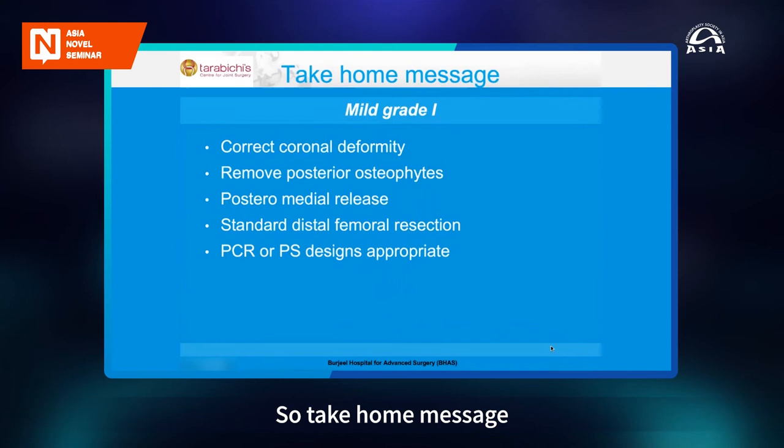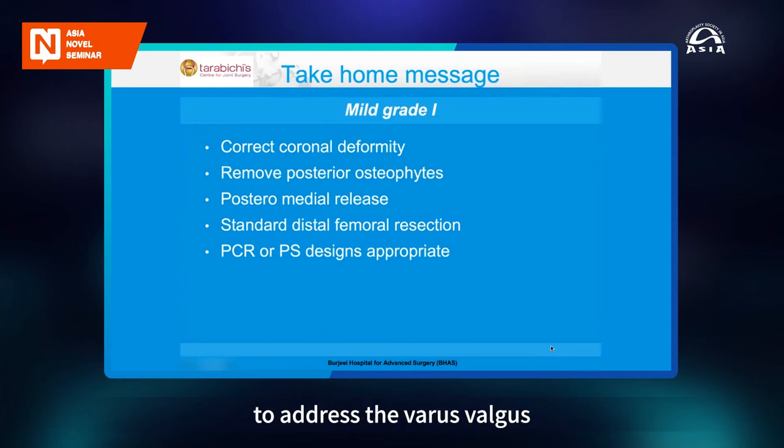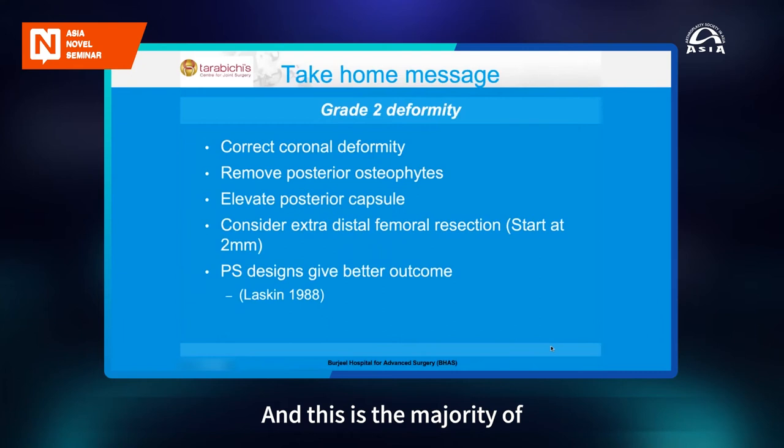So, take home message: in mild cases, you naturally have to address the varus valgus, and mild meaning less than 15 degrees. I think by removing the osteophyte and doing the posteromedial release, you can use a primary implant safely. And this is the majority of your flexion contracture cases.